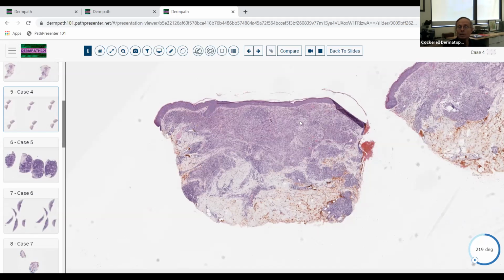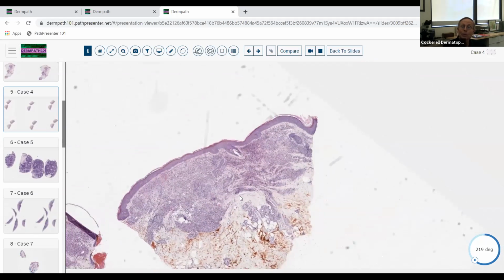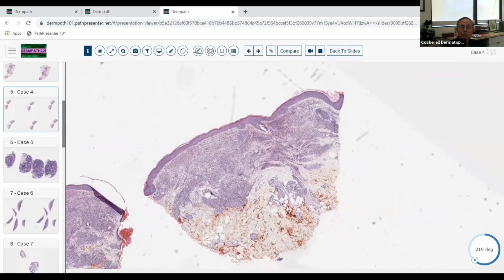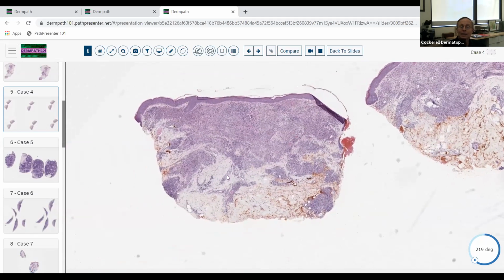And most of the inflammatory infiltrate may have wiped out, say, any sebaceous lobules, but there are some minor, little miniaturized vellus follicles here and some sweat glands. So let's just say that this is maybe on the cheek. Maybe it's not on the nose. There's a lot of sebaceous lobules, but let's just say for the sake of argument that it's definitely on the face. It's not on acral skin. So we got this nodular dermatitis.